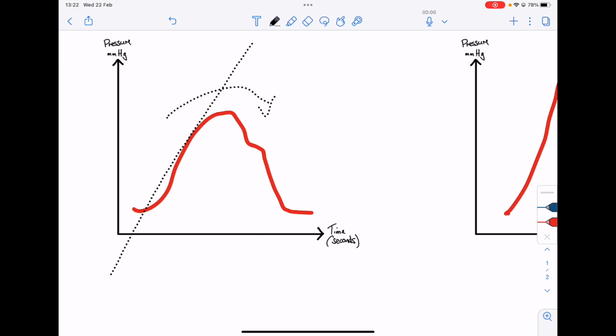You could also argue that failing myocardial contractility in either a failing heart or a heart that has been exposed to an internal milieu that impairs the function of your myocardium could also present like this. And when I say internal milieu, you can think of it as drugs circulating in the patient that are messing with how the myocardial muscle contracts, the electrolyte state in the patient impairing contraction, and then, although perhaps considered also an electrolyte, the acid-base state of the patient.